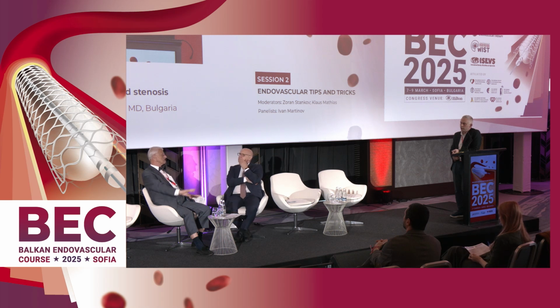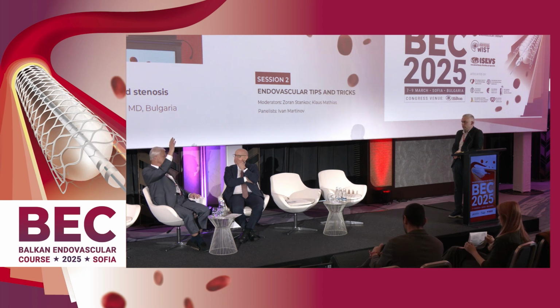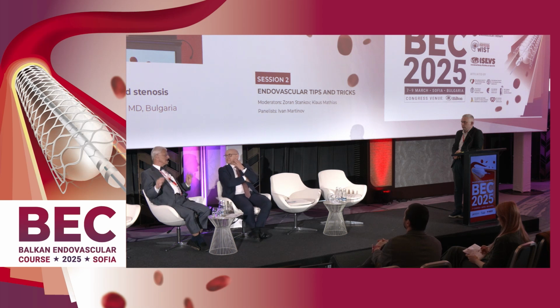So you have no flow to the cerebral arteries, and then you can produce an underpressure when you have placed your stent and dilated the lesion, so you get out the blood, which is there with all the possible tiny particles.